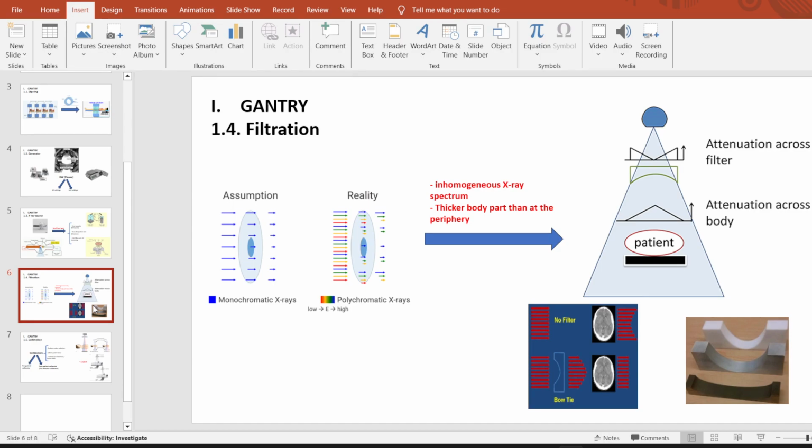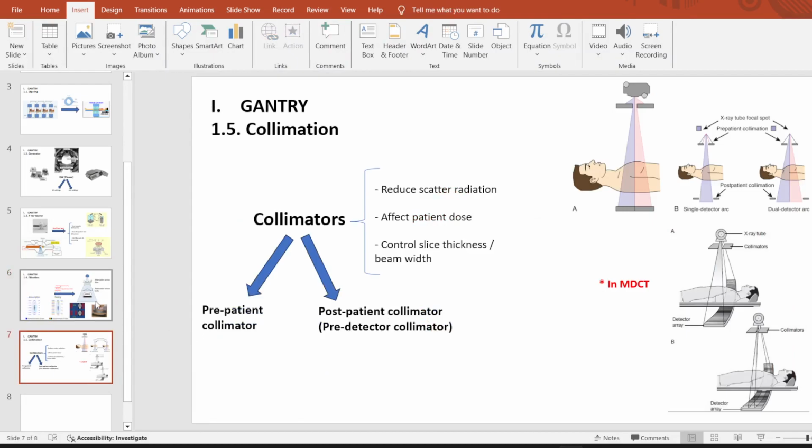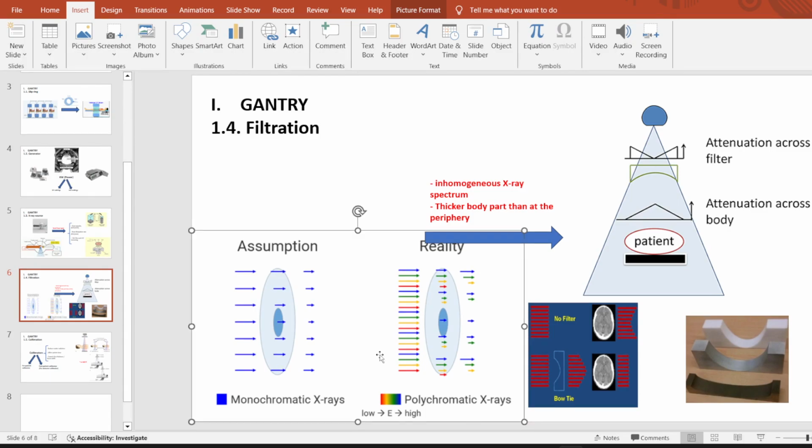Monochromatic X-ray is part of, yeah, there is another term, polychromatic X-ray. Here I want to zoom out the picture so it's easier for us to focus. Monochromatic X-ray and polychromatic X-ray here. So let me keep it simple. X-ray is a kind of light, an electromagnetic waveform, right? And light has a spectrum, meaning there are many photons with many wavelengths in that single light.